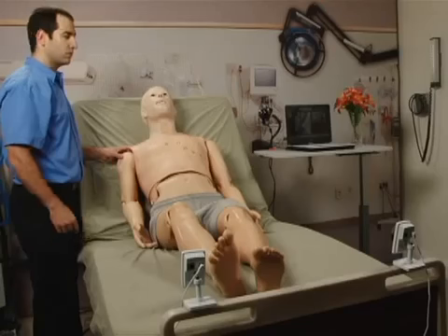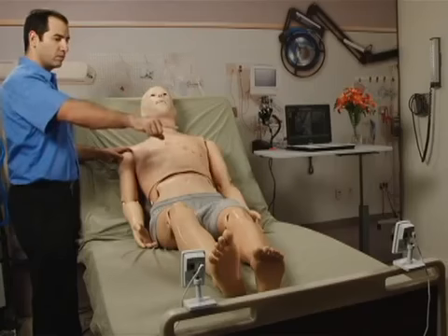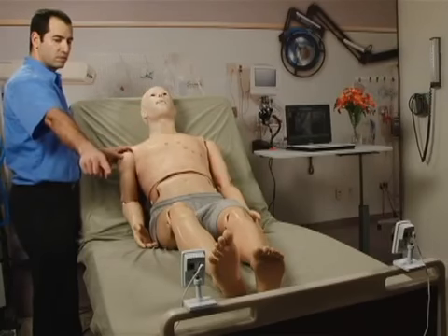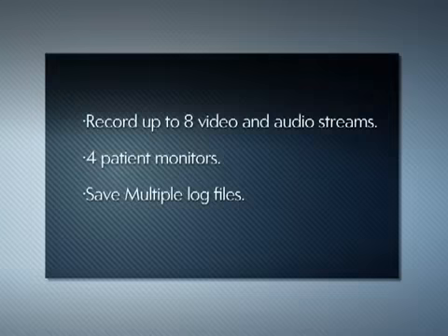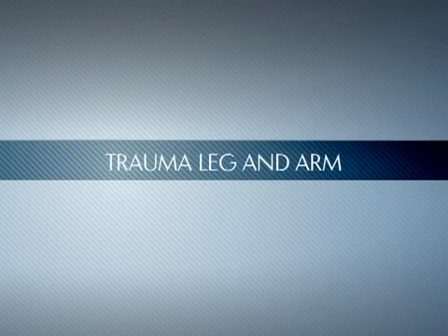The Pro Plus comes standard with a pan, tilt, zoom USB camera and 2 Wi-Fi cameras. The system will allow the user to record up to 8 video and audio streams, 4 patient monitors, and multiple log files.